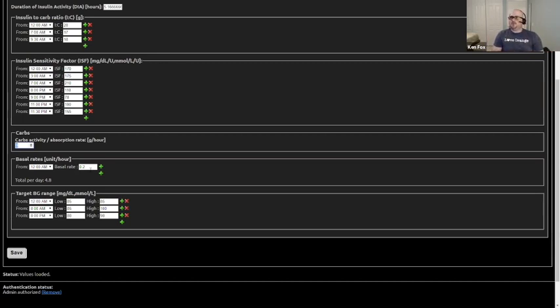So if you ate a bunch of food that would only take 2 hours to consume, to kind of work through your system, 2 to 3 hours. If you ate a lot of it, it would take a lot longer to do it. That's the idea. So like a big meal. So we don't use that feature. So when Loop uploads the data into the profile, it just leaves it at 0.